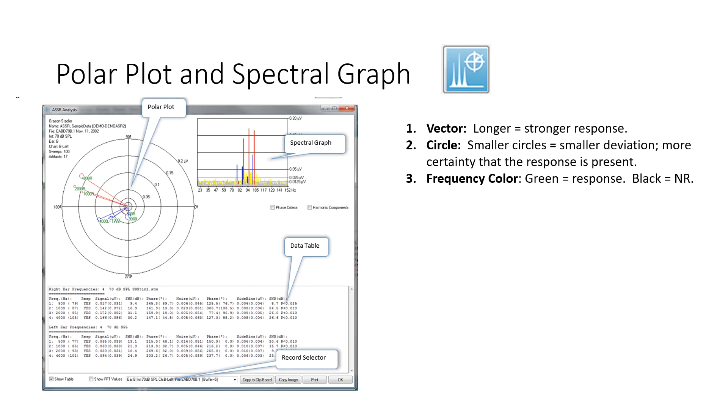The polar plot has a lot of information, so I'm going to go through each section. For the polar plot, you have vectors. Those are lines. The longer the line, the stronger the response, so the bigger the amplitude.